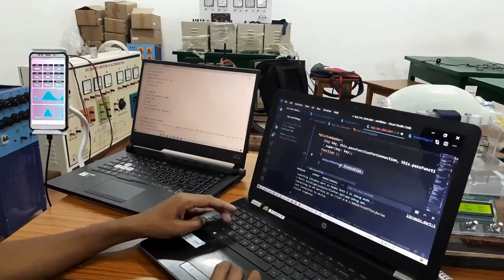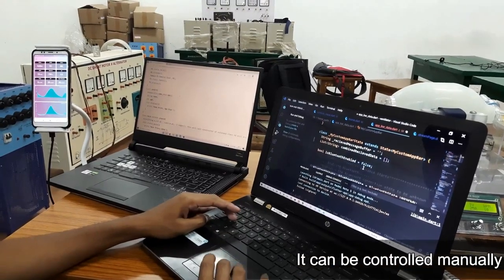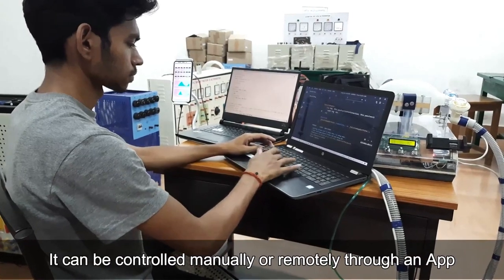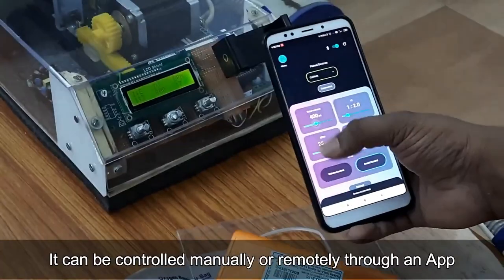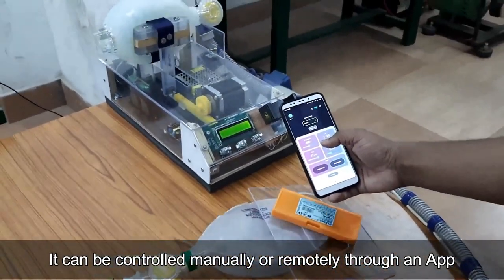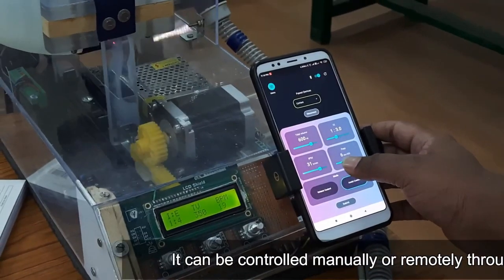The main objective behind the development of an app is to keep the medical staff and the doctors safe by remotely controlling the ventilatory parameters outside the ICU and also by monitoring these parameters and the waveform through the app, which makes the design novel as it is a no-contact use between the patient and the doctors.